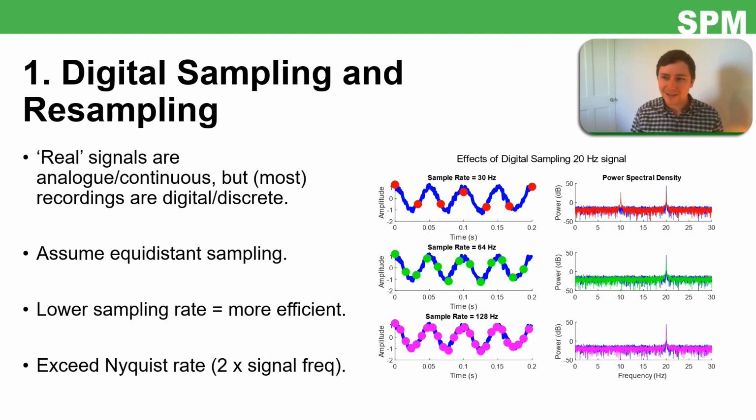What does this mean practically for actually doing EEG and MEG? Because if you think, well, the signal I'd like to observe, maybe I'll only be looking at alpha, 12 hertz, or 10 hertz being the central frequency, then I just need to sample at 20. I don't actually know what would happen if you did that, but I guess all of those high frequency signals would alias.